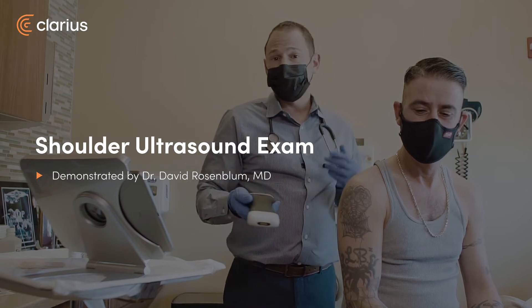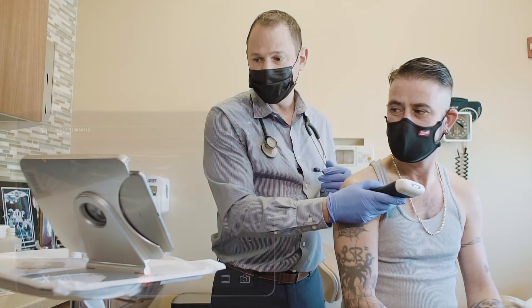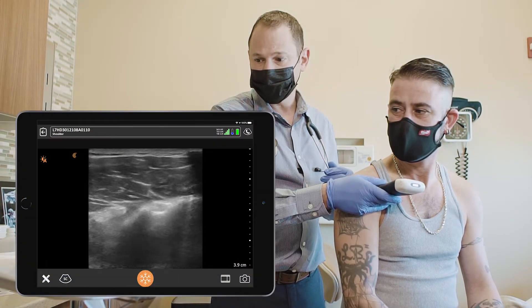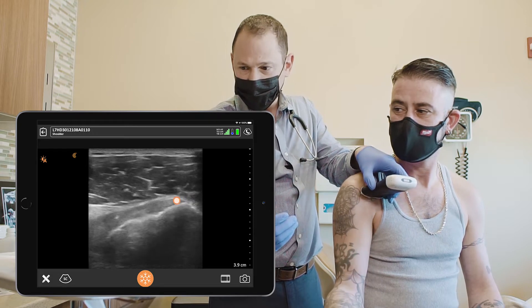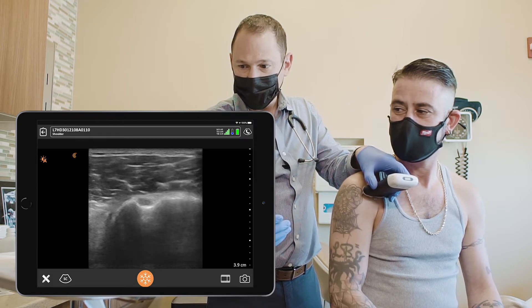We're going to display how we examine the shoulder with ultrasound. First, we find the biceps tendon — that's a cross section of it in the groove of the humerus. You can identify the subscapularis tendon by having the patient externally rotate his hand. There you go, come backwards — that is the subscapularis.